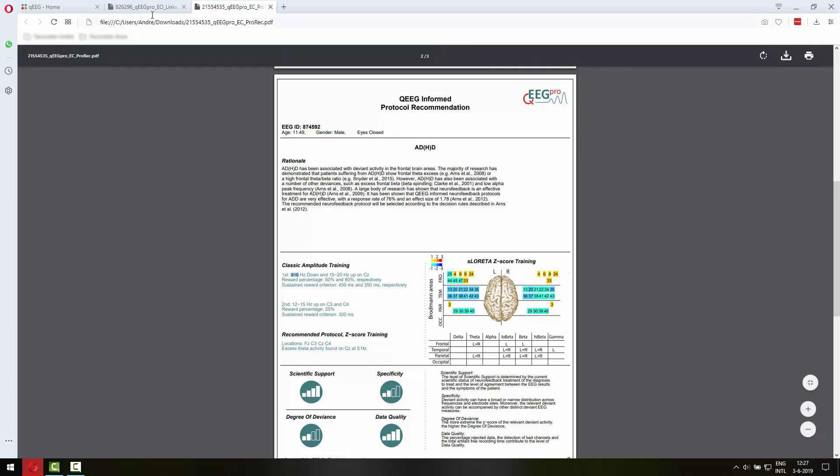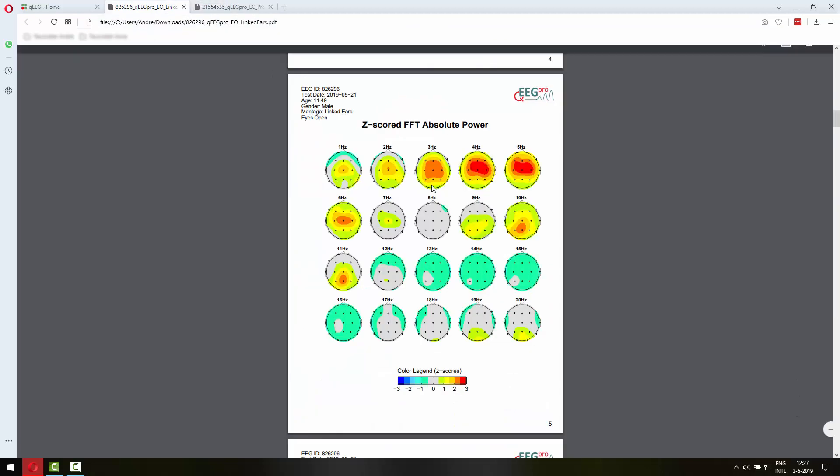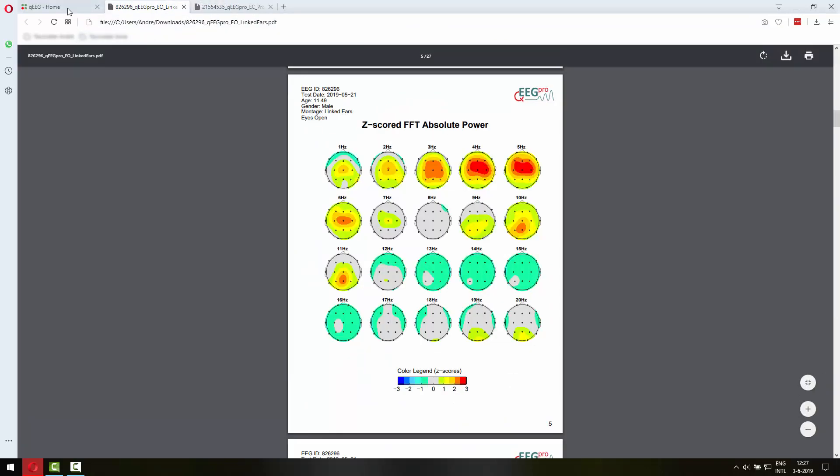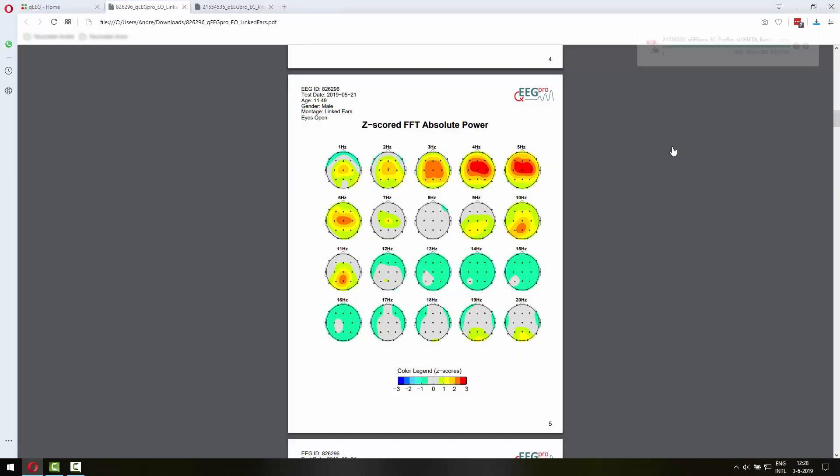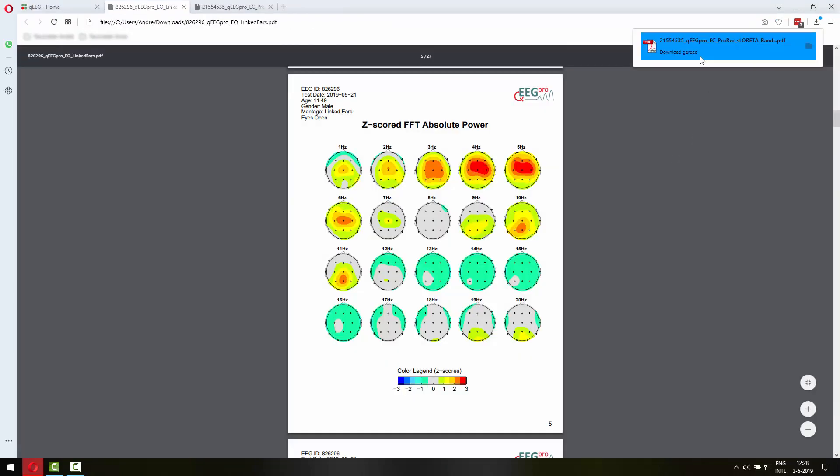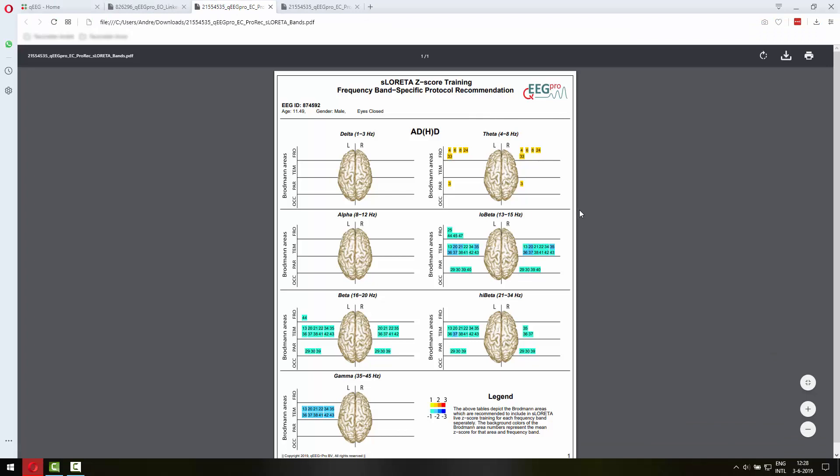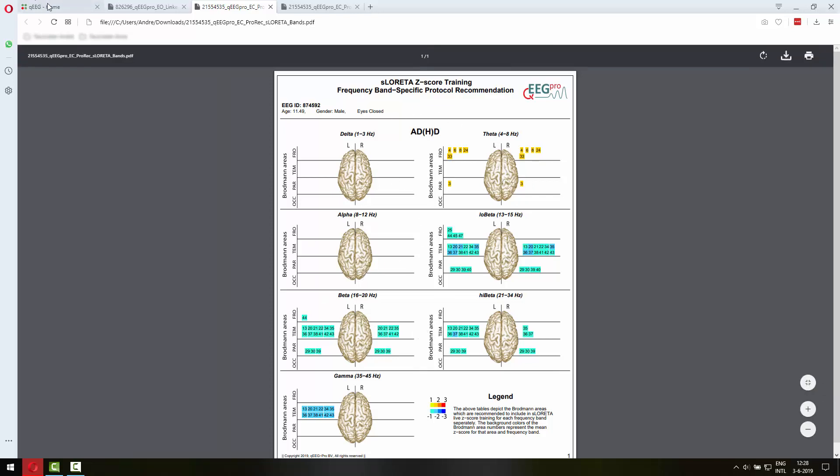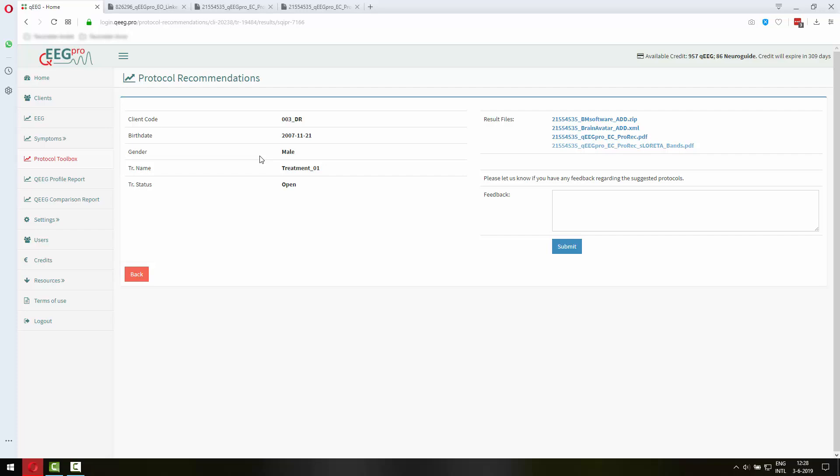So in order to have the full information you need to go to the QEEG Pro ProRack sLoretta bands report. That will show you for each frequency band which Broadman areas to include. So this is a lot of work to do in the Brain Avatar software and in order to make it more easy it is now possible to request a settings file for the Brain Avatar software.